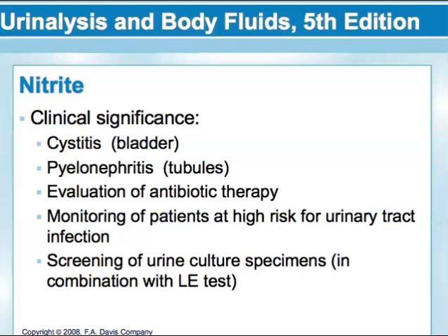The nitrite test can also be used to monitor antibiotic therapy and to screen patients who have recurrent UTIs or who are more prone to UTIs, such as diabetics and pregnant women.